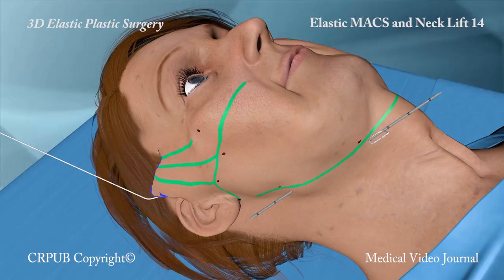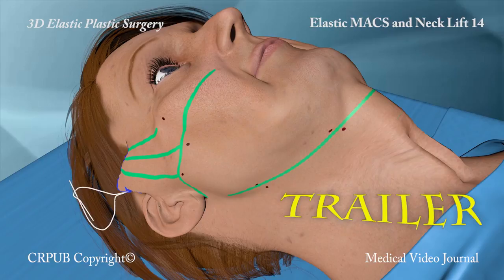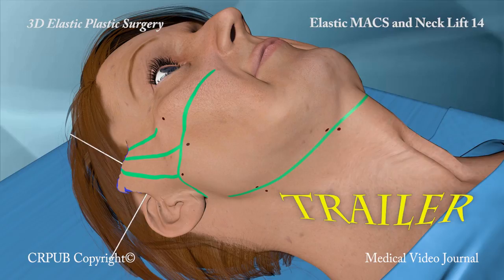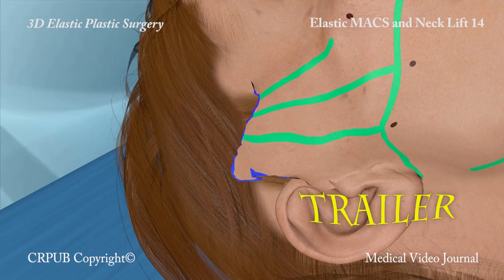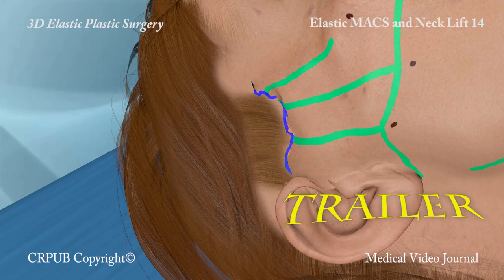The elastic thread is tightened and knotted. The cervicomandibular angle is now well defined. All the vertical excess skin is now removed, and the deep tissues of the flap are sutured to the temporal fascia. An absorbable intradermal thread is used to complete the dermal suture.